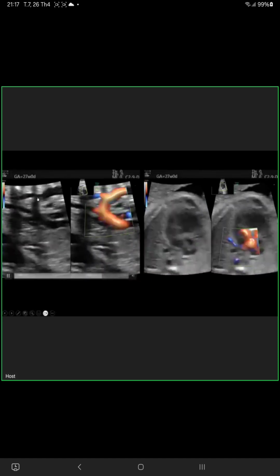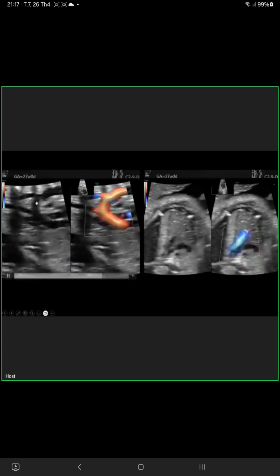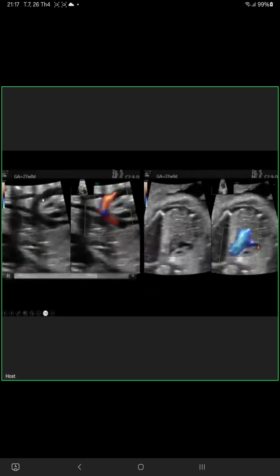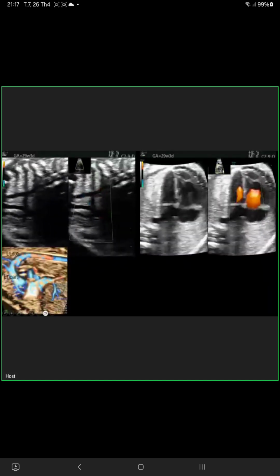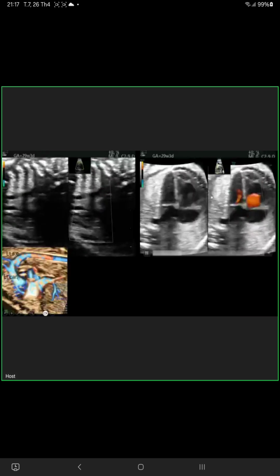The left subclavian coming in the place far away from the left carotid. Asymmetry in almost 30, prominent asymmetry.